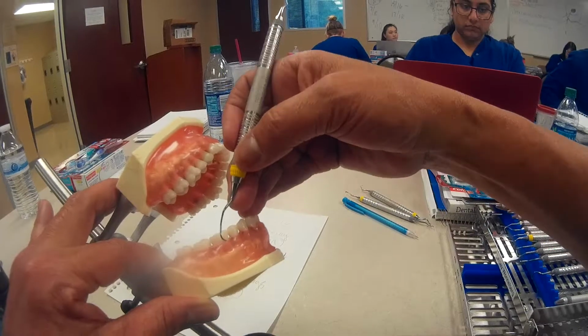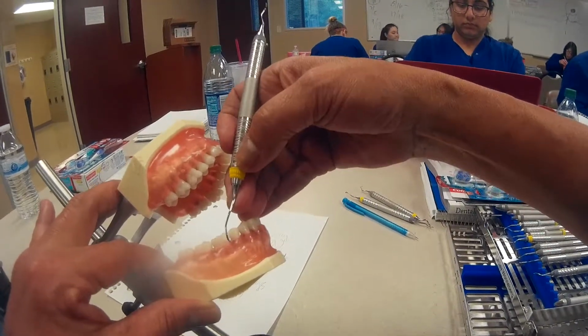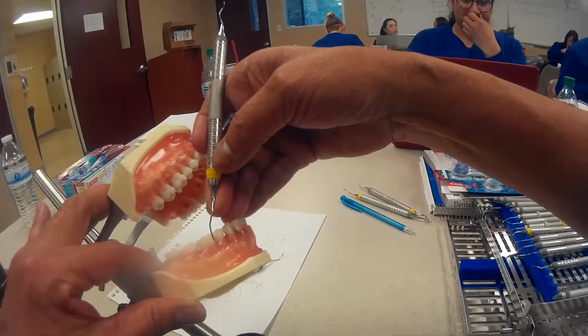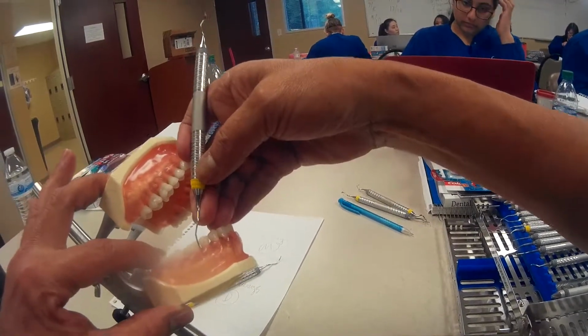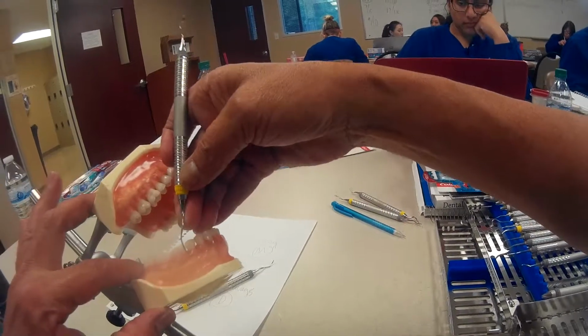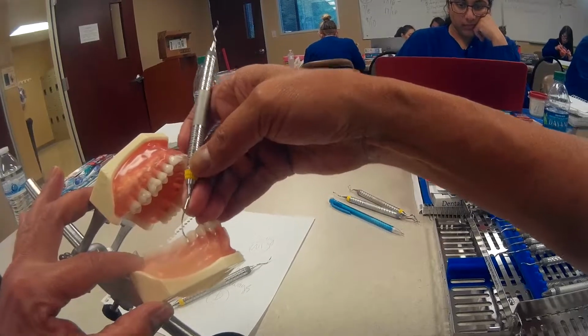and I'm going to pivot and stand up on my pivot on my forefinger, and then make my way into the mesial. And as you can see, that terminal shank is standing straight up, which is my visual clue that this working end is at 70 to 80 degrees, correct adaptation for calculus removal.